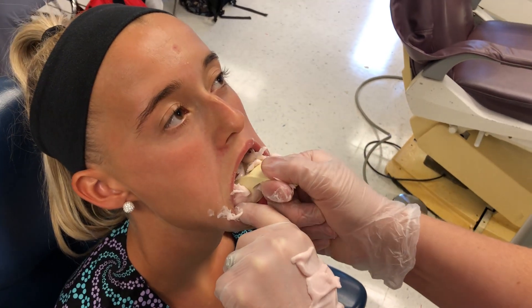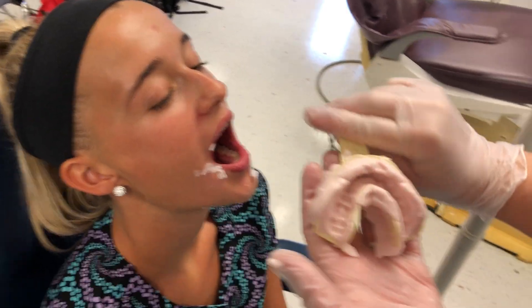Pop it out in the back, in the front, and that's the impression.